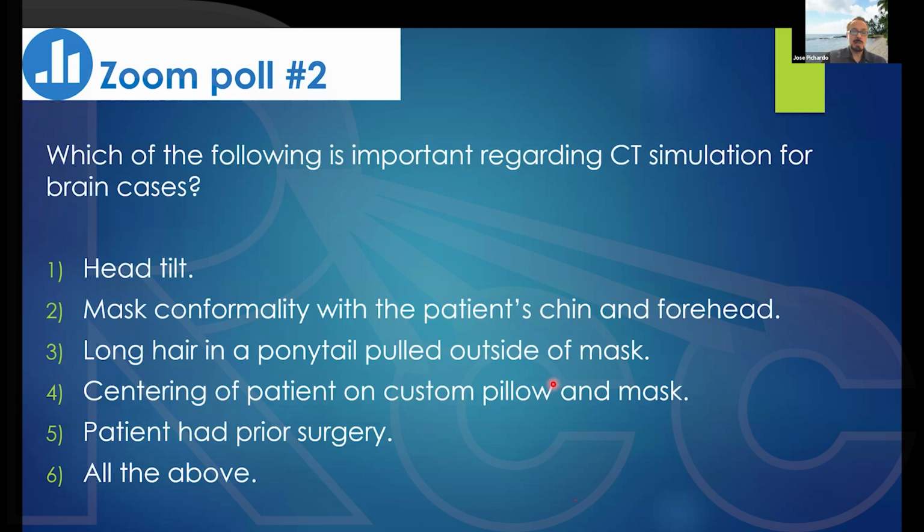Again, just as a reminder, that's why it's important to be present at each one of the phases of the patient. If you're present during CT sim, then you can correct all of these things if any of them have not been done before the planning even starts. Otherwise, you have to bring the patient back and redo the whole thing.